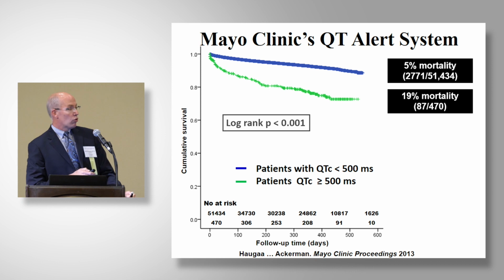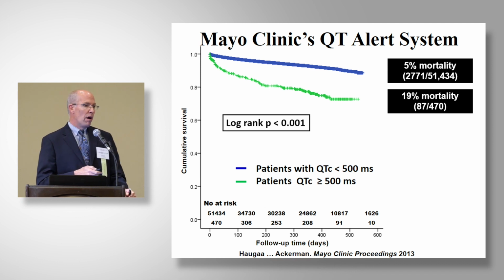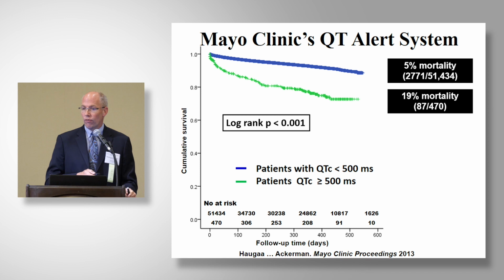It's actually 20%. A QTc above 500 is a marker of an unwell host, for which some of that we are accelerating their demise by not correcting their hypokalemia, by not removing the 5 drugs that they're taking, of which 4 of the 5 are on the QT hit list, and so forth.